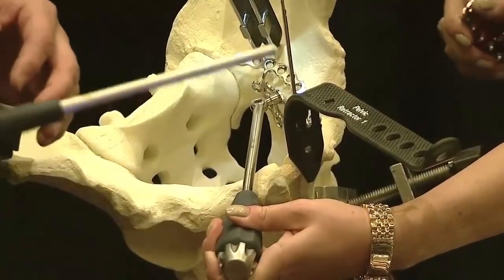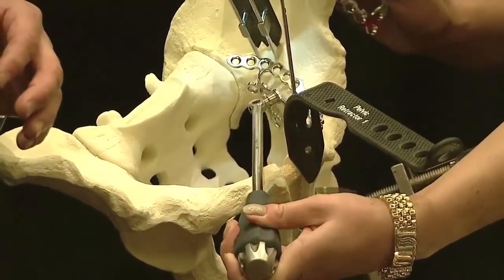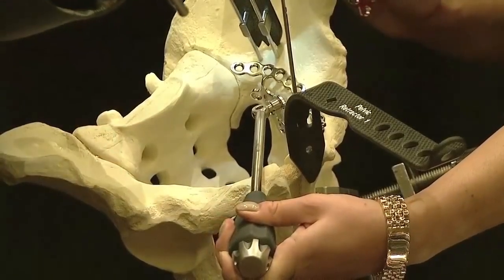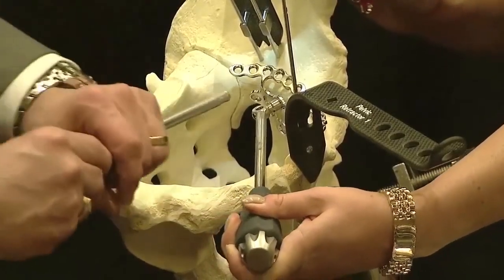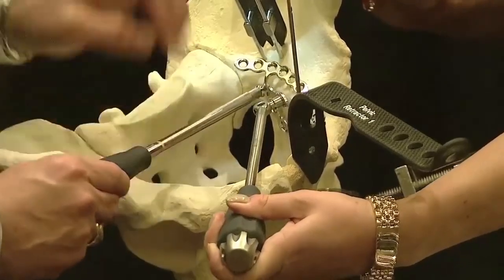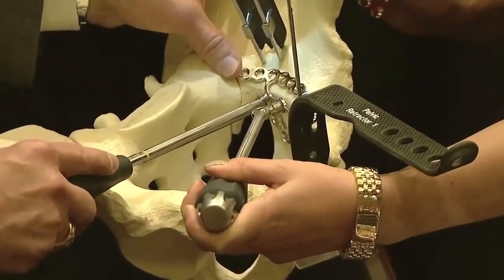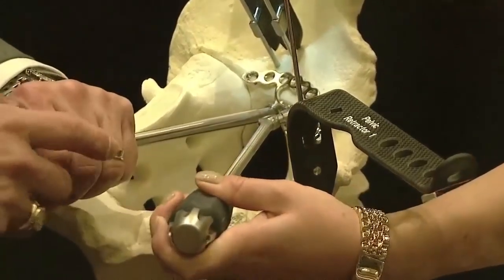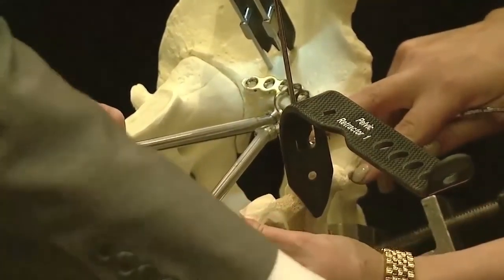Similar to the spike screw inserter, we have the cannulated plate screw inserter. And this works with the same concept. It's got the centering sleeve for the drill. I can work into the wound and I can center the plate kind of where I want it. Relax just a little bit. Get it where I think it goes. And then we'll put a screw in that. We'll do the same thing we did before.